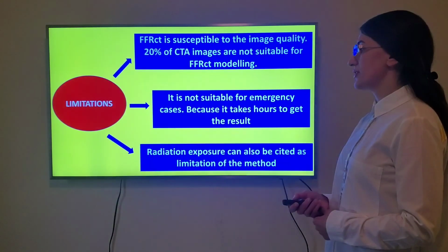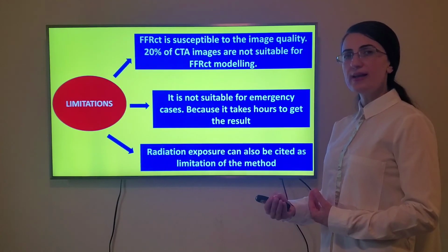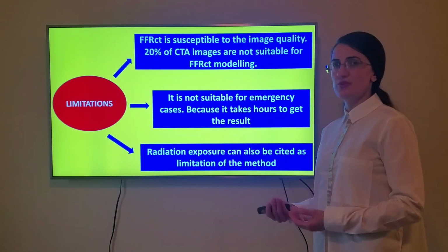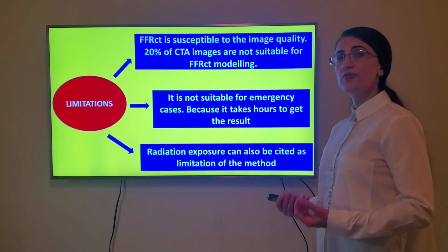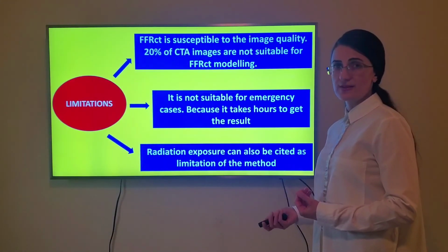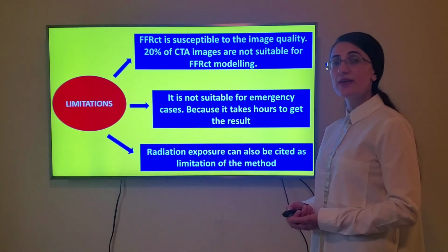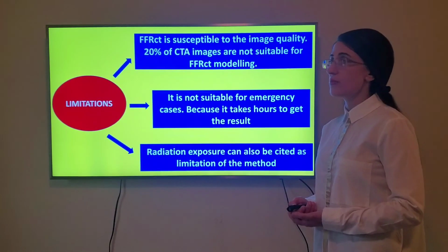The last limitation is radiation exposure. How? Because it is based on computed tomography images. The patient needs to have computed tomography angiography to get Heartflow analysis results. That's why the patient gets radiation exposure, which is another limitation of this method.